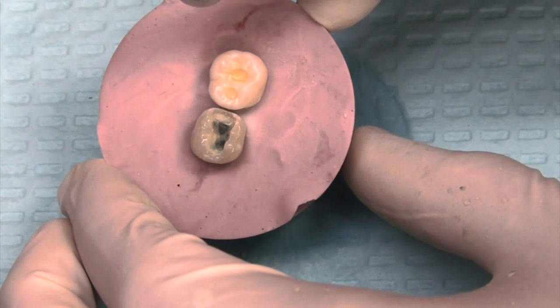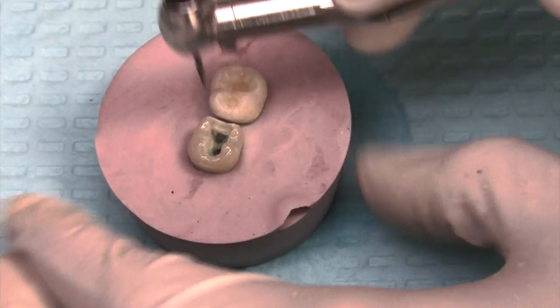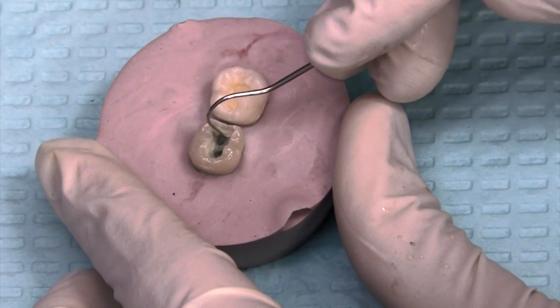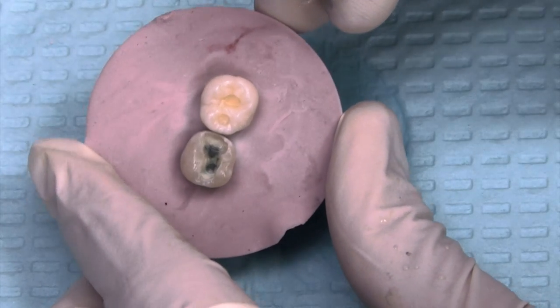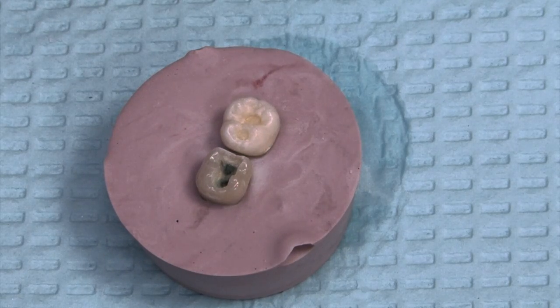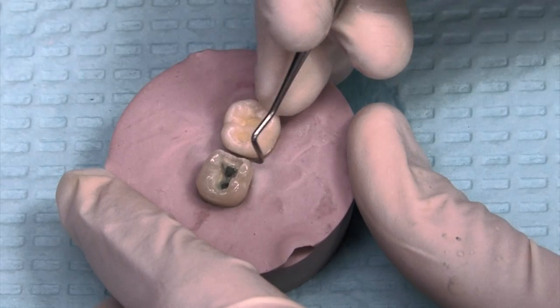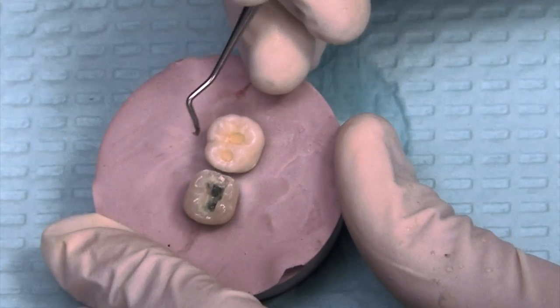I'm turning it around and evaluating how smooth that looks. We've got separation and that should work out great. It's not unusual to go along with a hand instrument just to make sure everything is fine. We're going to check the floor of the tooth, make sure all the decay is removed, nothing is sticky. The dentin is solid and hard, so we feel pretty confident about placing a filling in that area. I'll take a scaler just to smooth that wall to make sure we're going to have a nice gingival part of the filling when we put in our matrix.